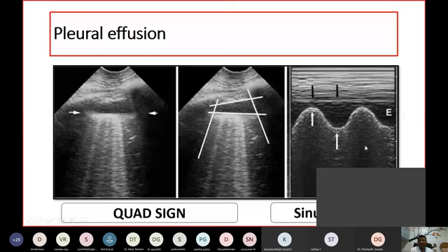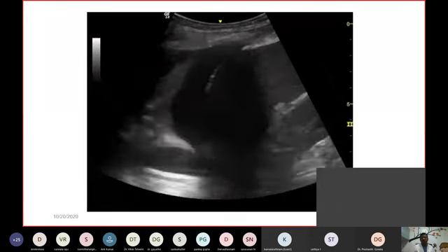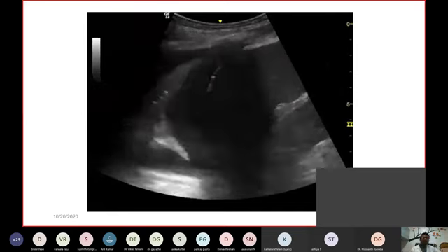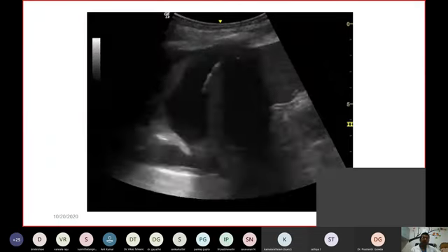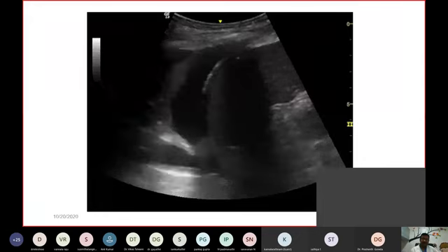Now, again, look at this video. We saw this video earlier. So at Plapp's point, you'll see effusions nicely. Why is Plapp's point examination very important? I told you Plapp's point stands for posterolateral alveolo-pleural syndromes. Most of the alveolar syndromes and pleural syndromes, unless they are extensive, you're going to get them in the lower part of the lungs.